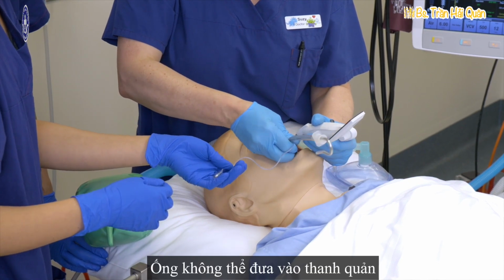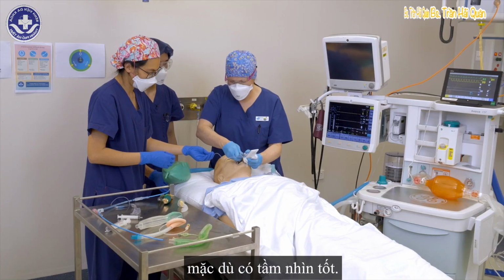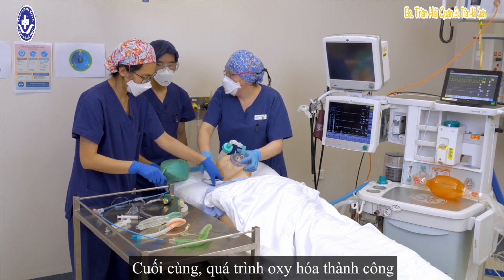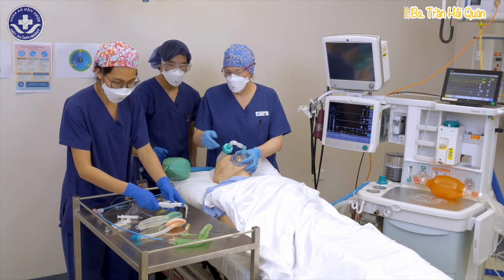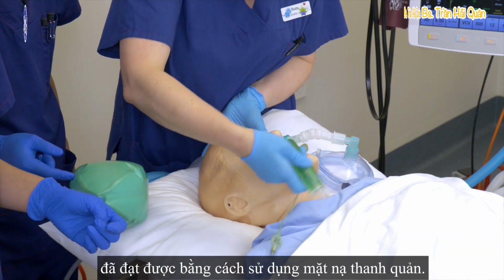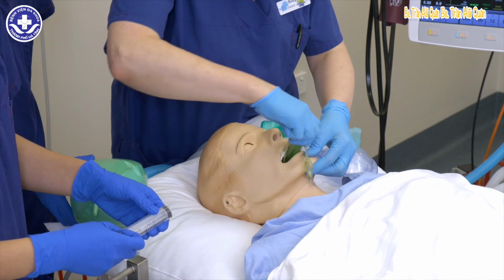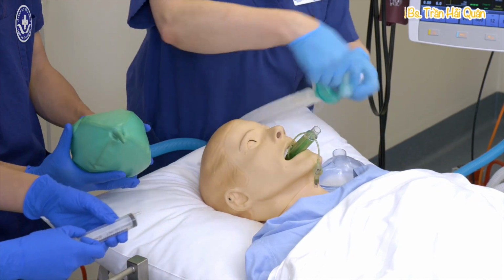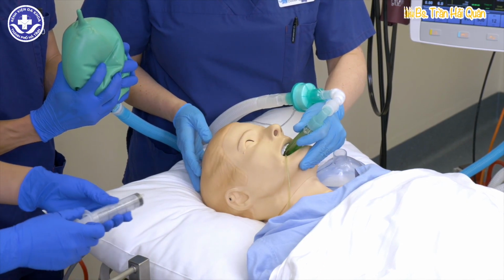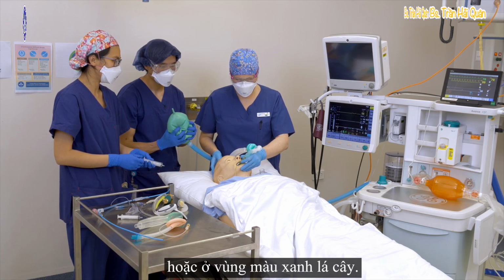The tube is not able to be passed into the larynx, although there is a good view. Successful oxygenation is eventually achieved using a laryngeal mask airway. The patient is now safely oxygenated or in the green zone.